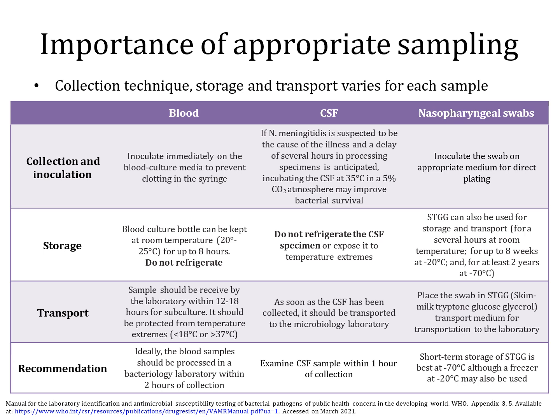While the CSF samples need to be processed within 1 hour of collection, and should be immediately transported in a fluid bottle to the microbiology laboratory, or in the enrichment medium. Do not refrigerate the CSF sample, like the blood sample. And if fastidious organisms like Neisseria meningitidis are suspected, then inoculate into pre-warmed plates of chocolate agar, and then incubate in a 5% carbon dioxide atmosphere. This will increase the sensitivity or yield of the pathogen.